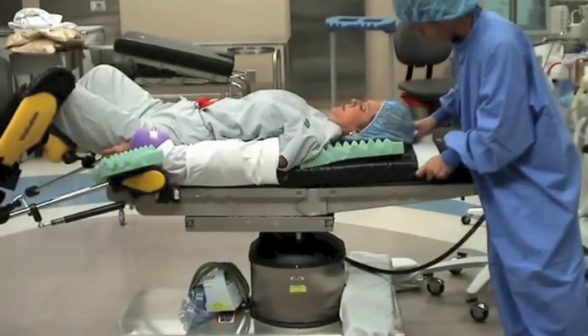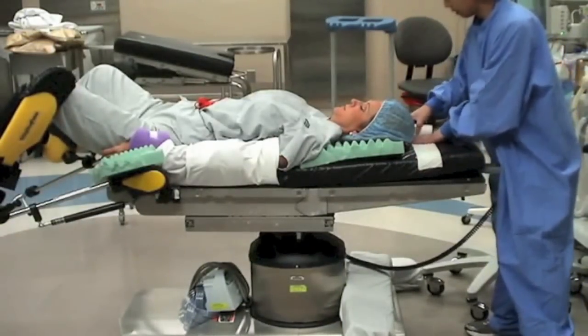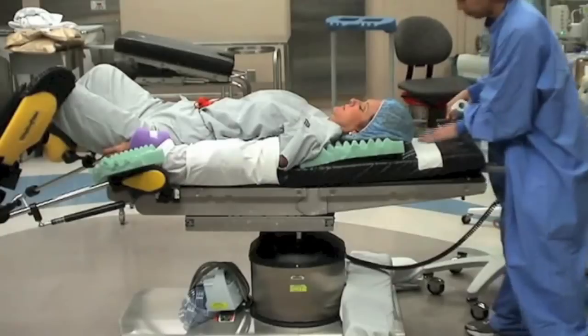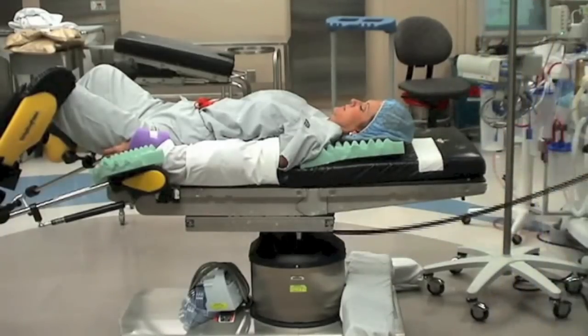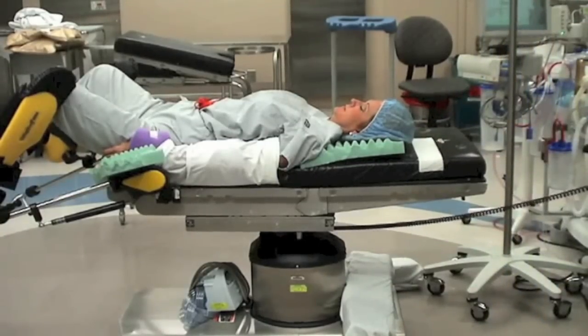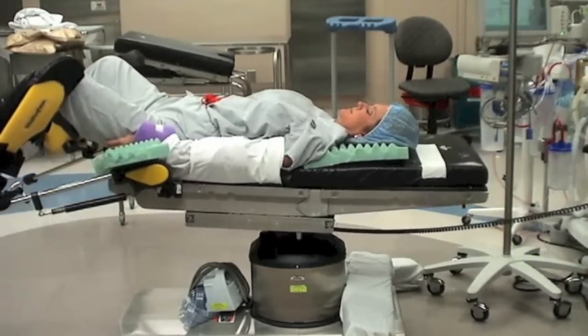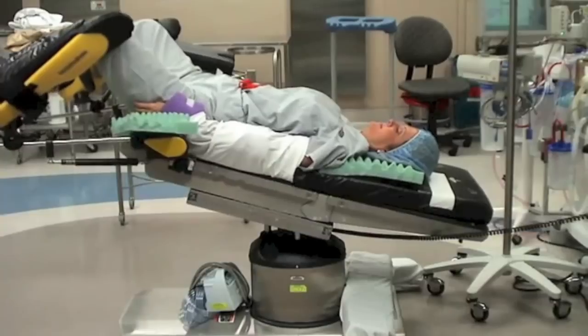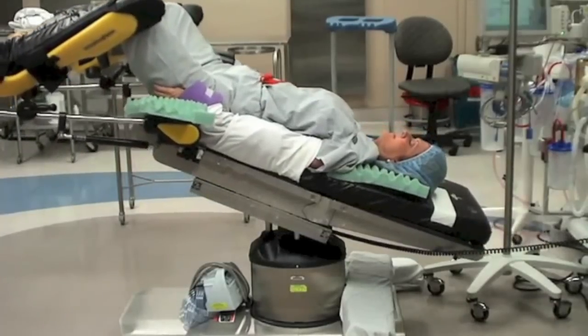To demonstrate that the patient does not slip significantly when placed in Trendelenburg, a tape marker is placed above the patient's head, and when the patient is placed in Trendelenburg, the patient's head location in relationship to the tape marker is not significantly changed.